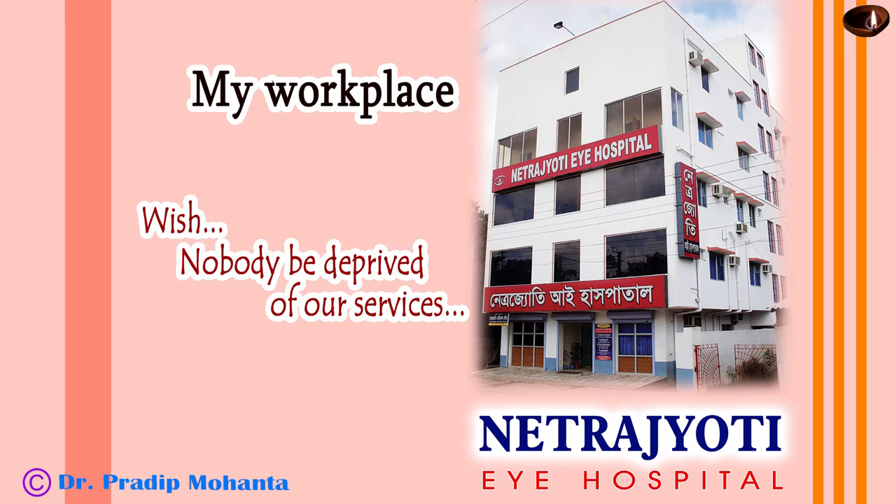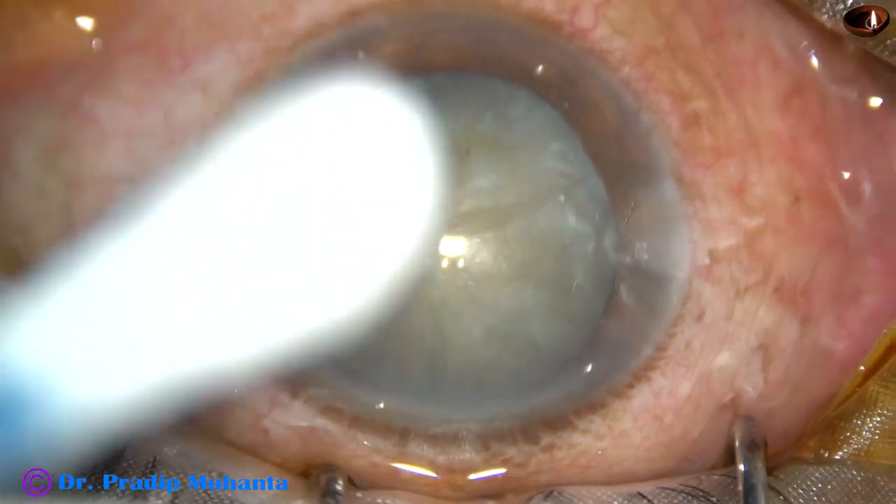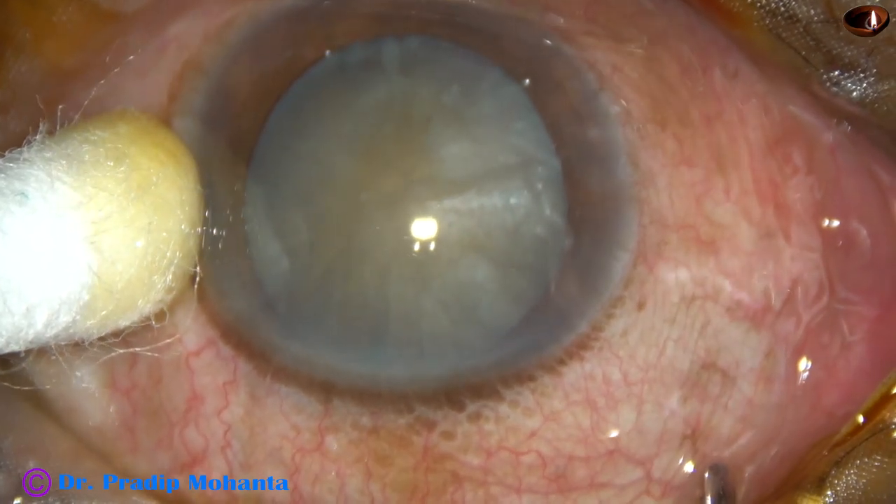Friends, welcome to my workplace at Ranaghat, West Bengal, India. This is a mature senile cataract. Let us observe the management of this case.